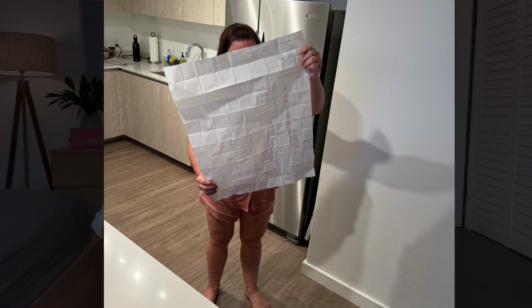Yeah. When I got the Stelo, I pulled out the directions and I unfolded the whole thing. The instructions are like the size of my body. Took a picture with me with the instructions. And I read them because, as you know, I was very nervous to put this in and make sure I was doing it right. So I read from start to finish. And honestly, I couldn't go back to see if maybe I missed this, but apparently there is an additional app called Clarity that you can use to actually track more of the history and the analytics and see your blood glucose over time.